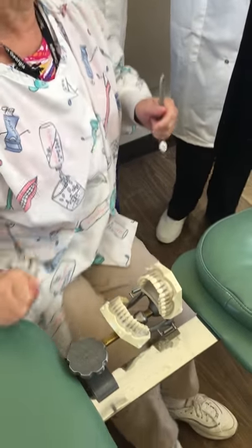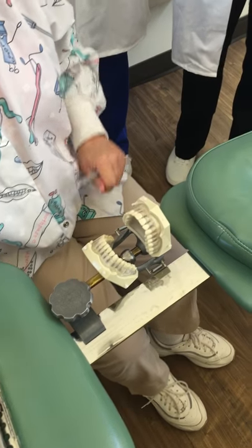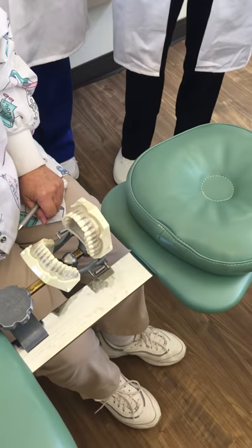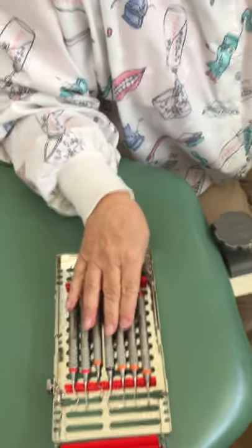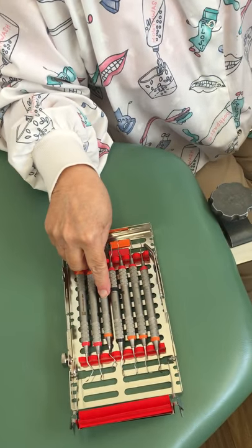We're working on areas 3, 4, 5, and 6 on the mandible. We're going to use the Gracie 1314, the Gracie 1516, and the Gracie 1718.